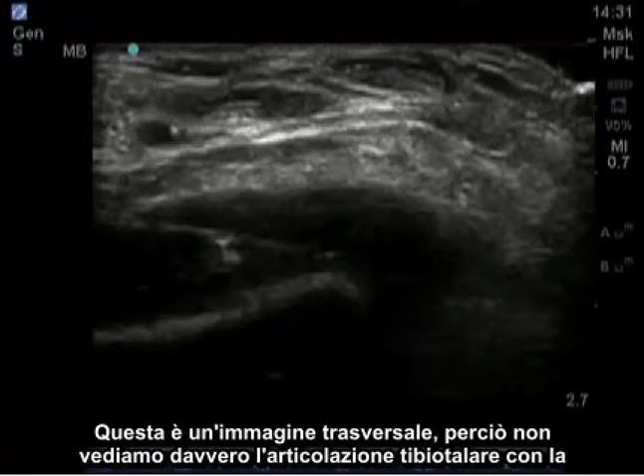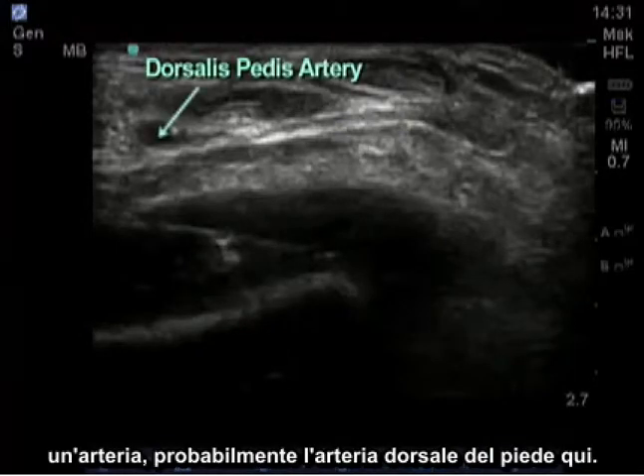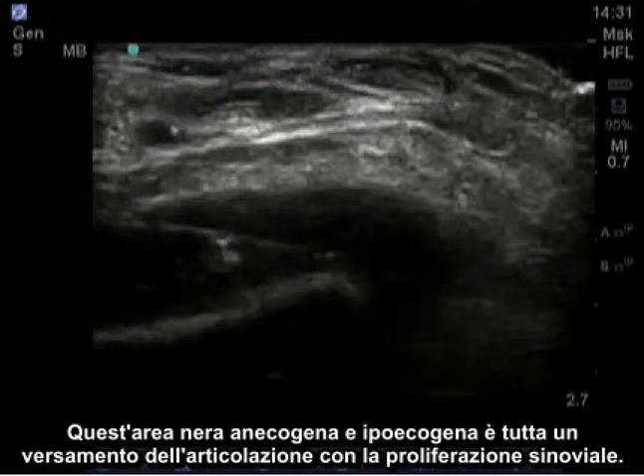Here is an image taken of a person with an ankle effusion. This is a transverse image, so we don't really see the tibiotalar joint with that classic V presentation. But we see the bone here, and we see an artery — probably the dorsalis pedis artery — and this hypoechoic and anechoic black area is all joint effusion with synovial proliferation.